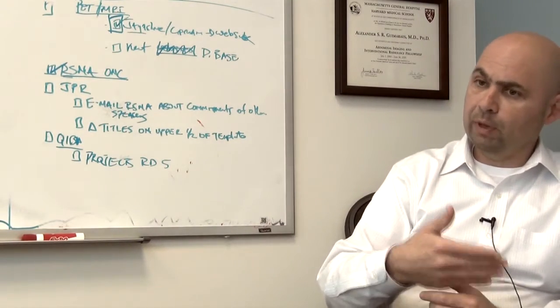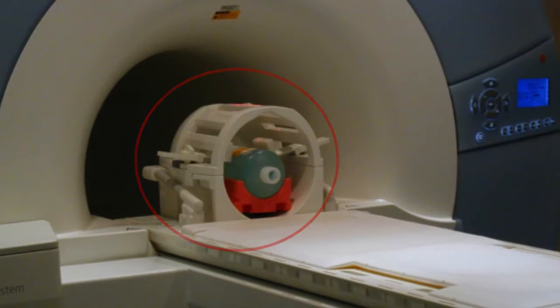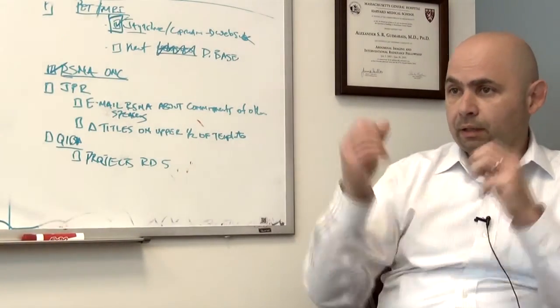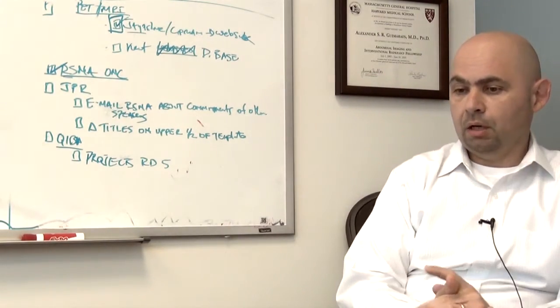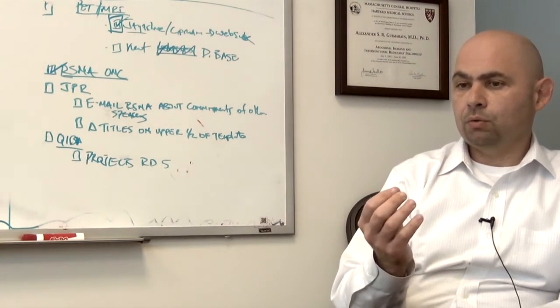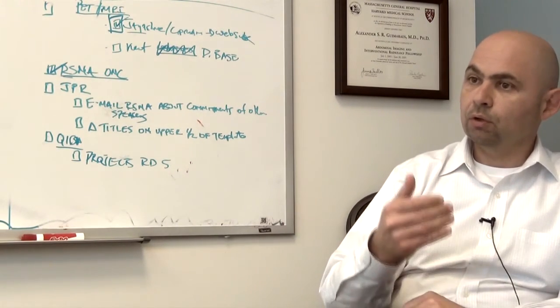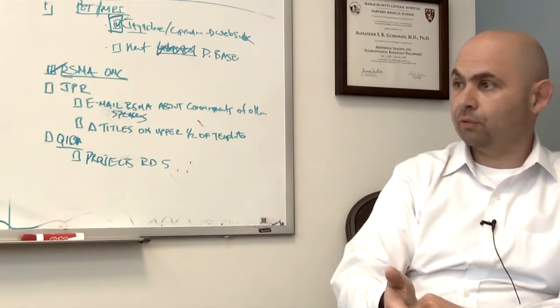The other way, the way we do it conventionally, is that when a patient goes into an MRI, they will put a radiofrequency coil around the body about the anatomic part that they're interested in imaging. Let's say it's your brain. Those coils are tuned to transmit and receive radio frequency information exactly at the Larmor frequency, right? So they're tuned to that frequency.